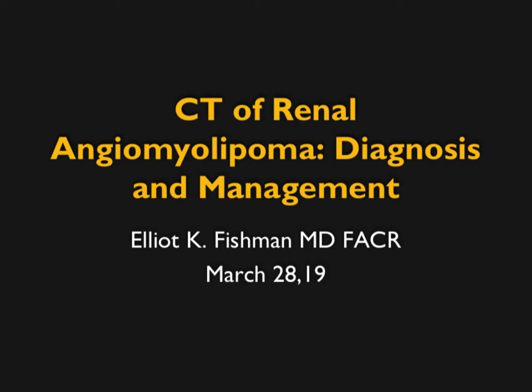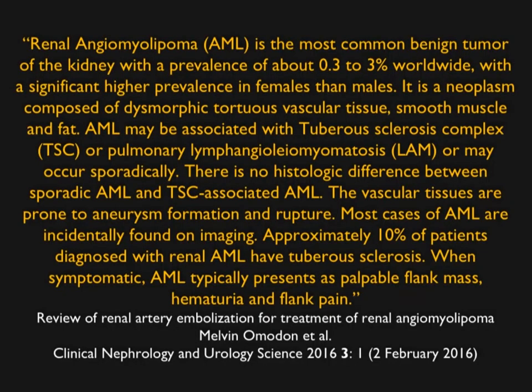In this talk I'd like to speak with you about renal angiomyolipomas, take a look at some of the facts about them, some of the newer things that are being discussed, and look at perhaps how we manage them. Renal angiomyolipomas are the most common benign tumor of the kidney, with up to a 3% prevalence worldwide.